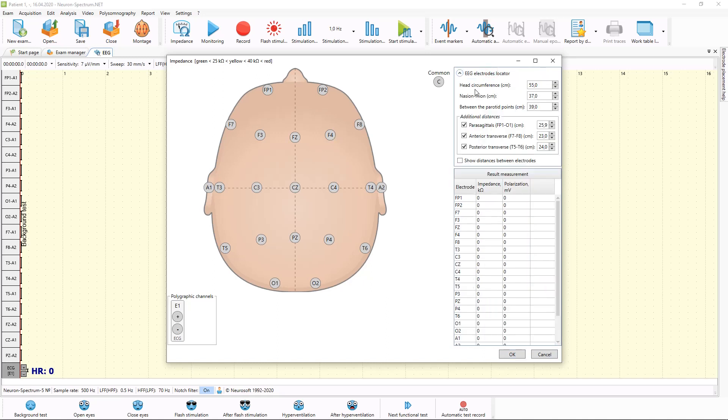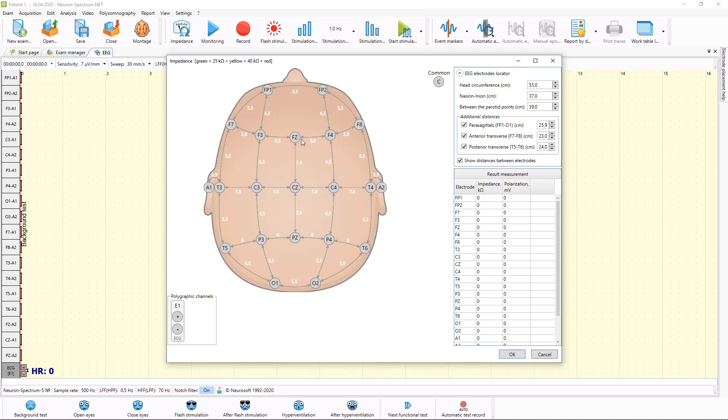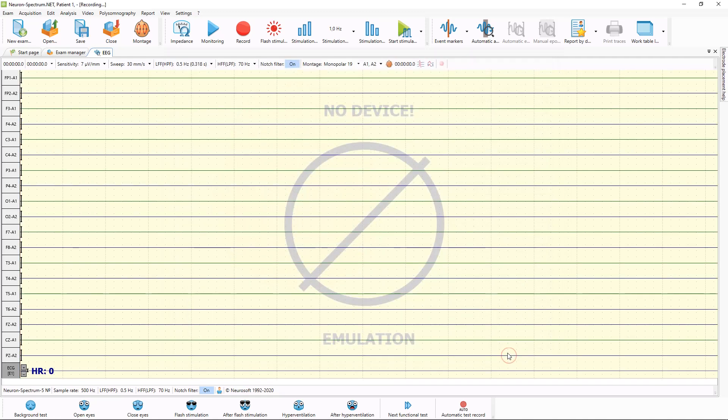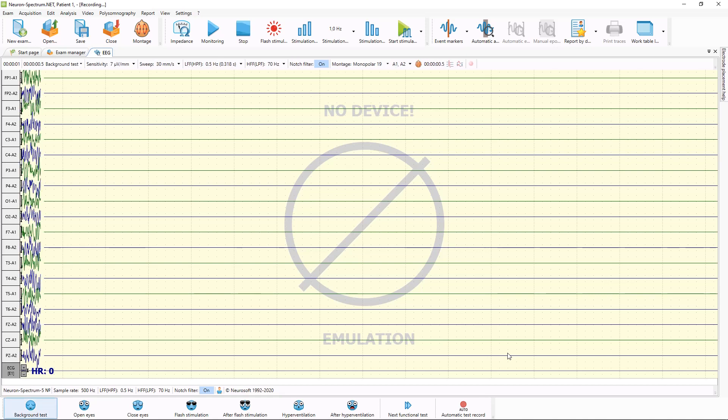Also to help nurse to put EEG electrodes to right position, you can use special tool called locator, which helps to put all electrodes on right positions. Here you will see the distance between each electrodes in centimeters, and this will help your nurse to put electrodes correctly. After impedance is in green area, you can press OK button to start recording.